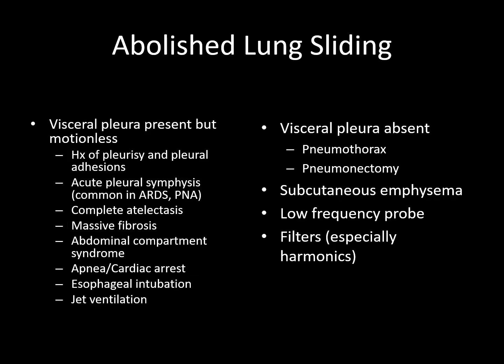There are numerous causes of abolished lung sliding: pleural inflammation and adhesions, and anything that prevents adequate ventilation can abolish lung sliding. Common causes include ARDS, pneumonia, mainstem intubation, as well as pneumothorax.